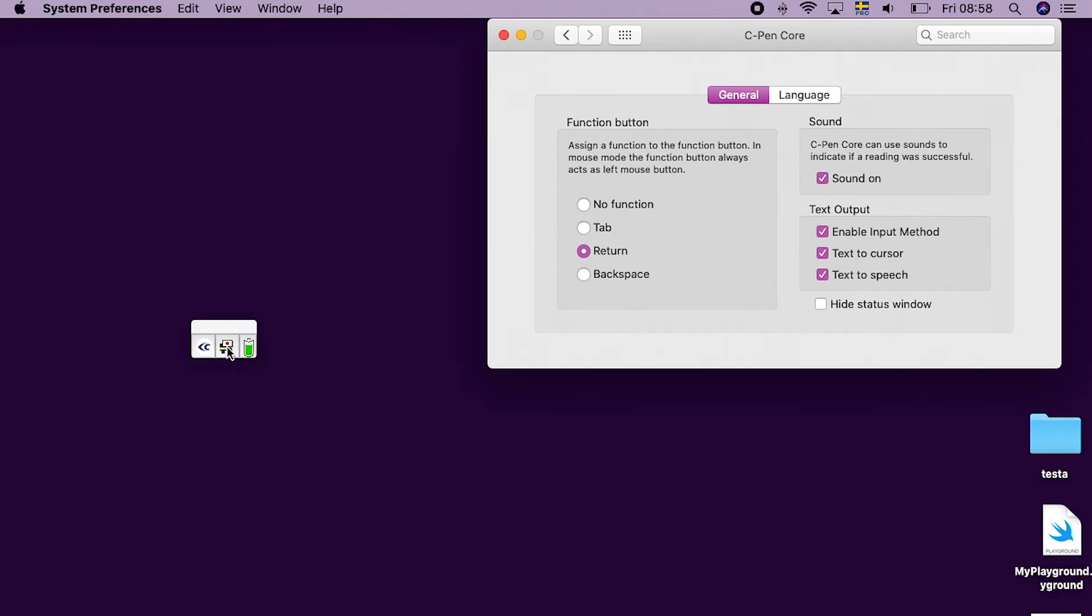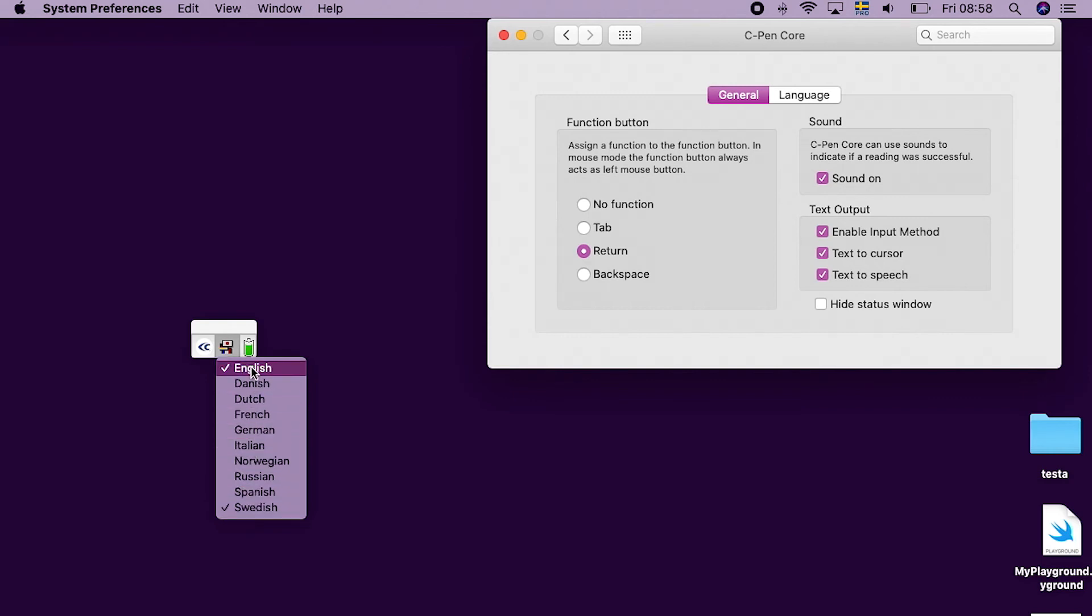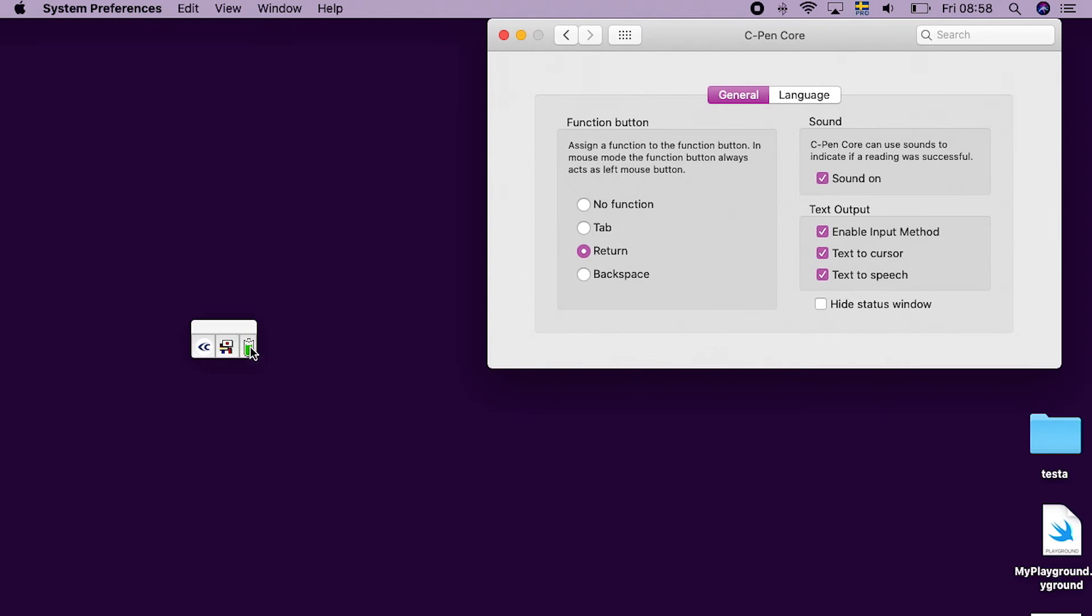Click on the flags to select Scan Language. If Text to Speech is enabled, a matching voice is automatically selected. Clicking the battery symbol shows battery status.